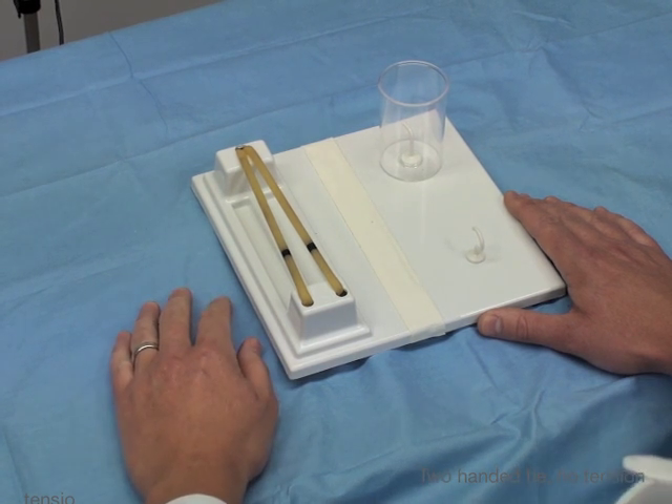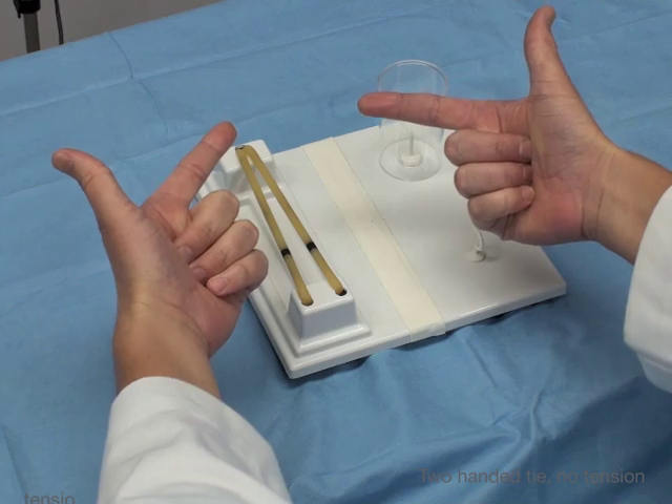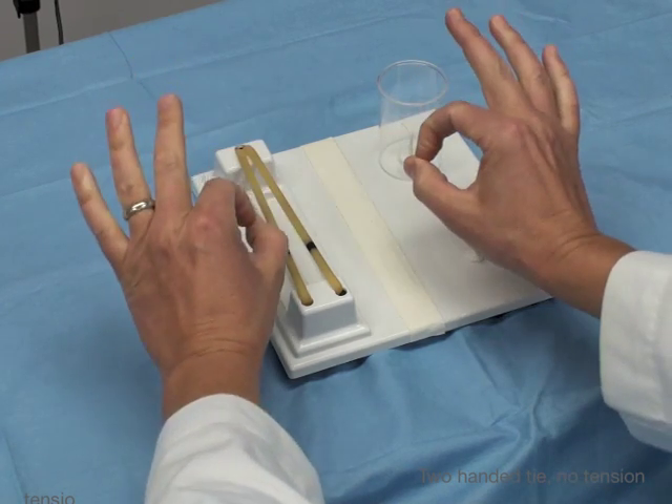Now we're going to talk about how to do a two-handed tie. There are two key hand maneuvers that you should learn to do this. One is the pistol position, the other is the perfect sign. So these are the two positions: the pistol and the perfect sign.